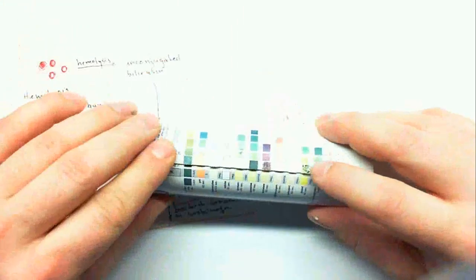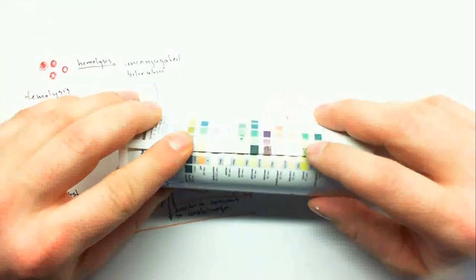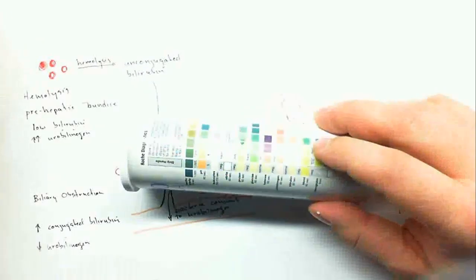Now if we took that same strip and we added blood, often in diabetes there's kidney damage, and that can actually lead to blood in the urine, and that's a problem in late stage diabetes.